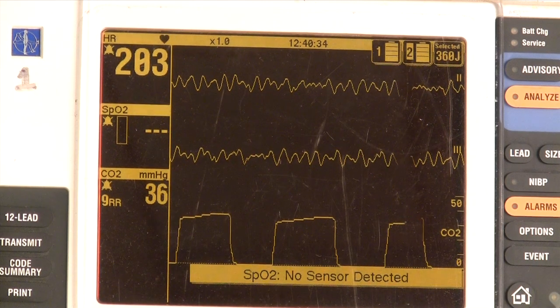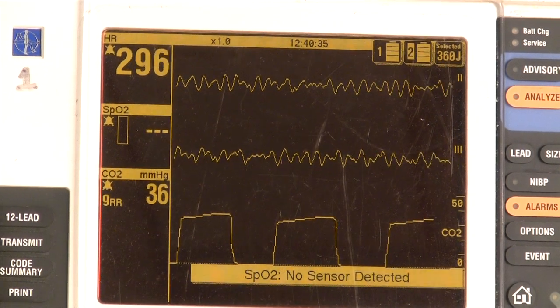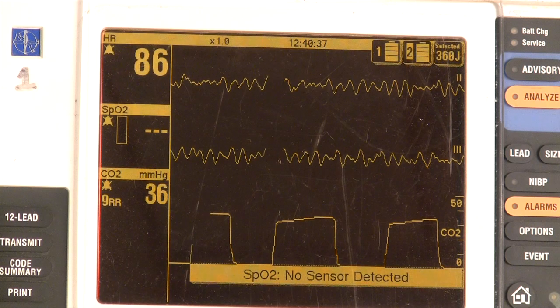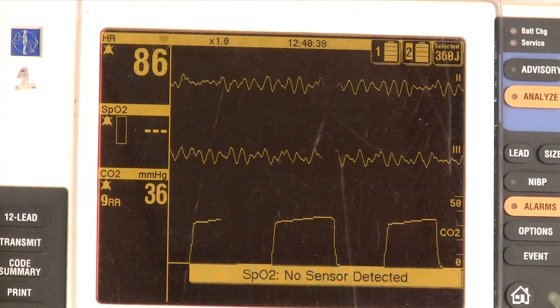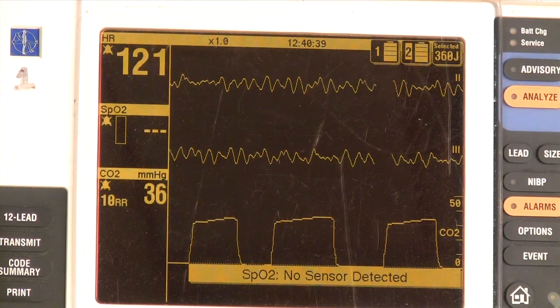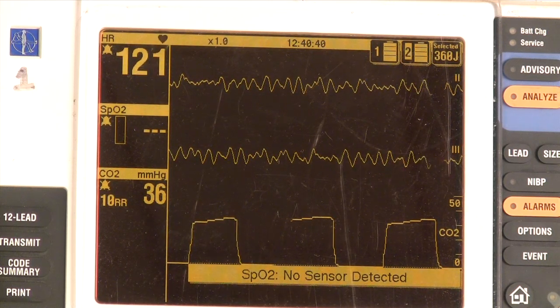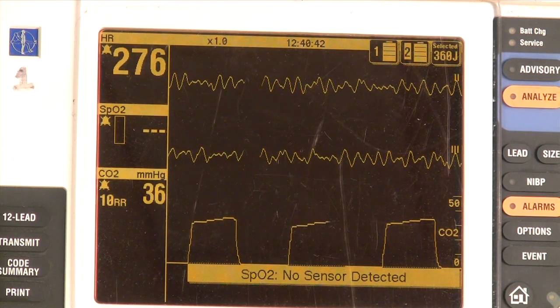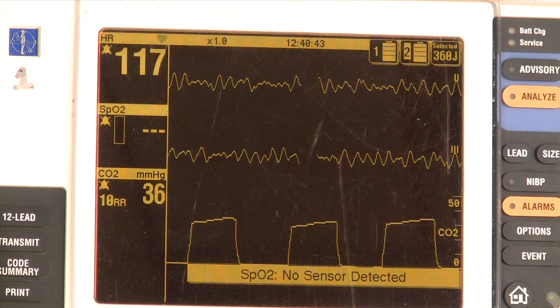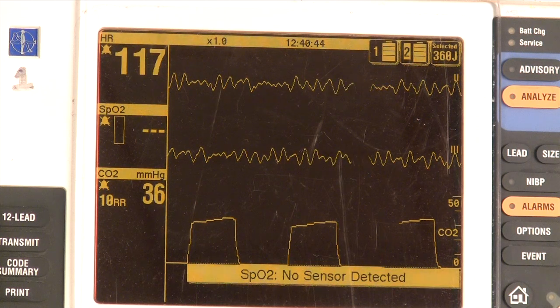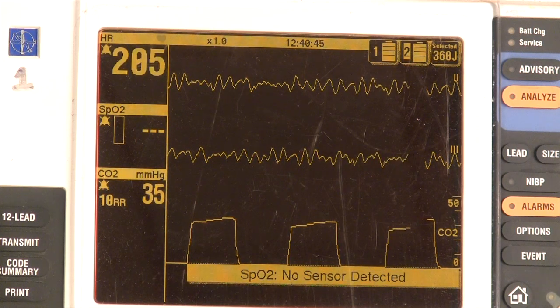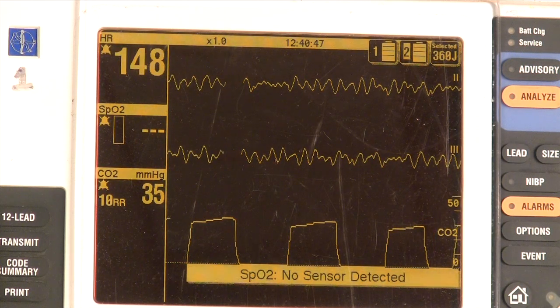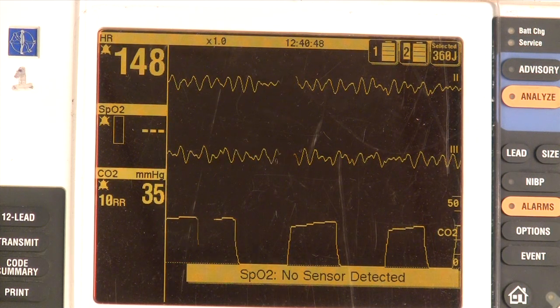In addition, waveform capnography is required to validate placement of the endotracheal tube at intubation or any time when the patient is moved. It's our only tool that tells us definitively that the endotracheal tube is where it belongs and has stayed there.